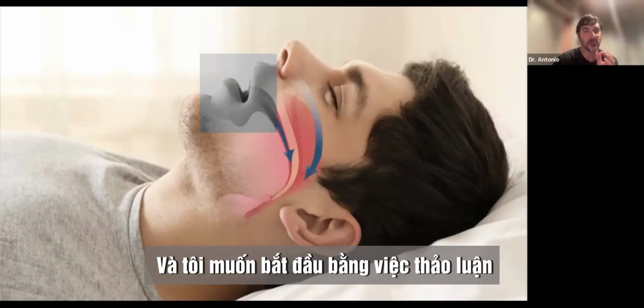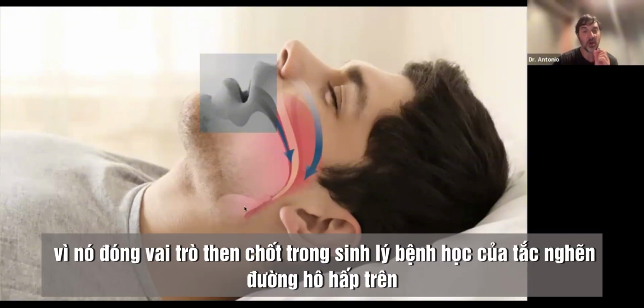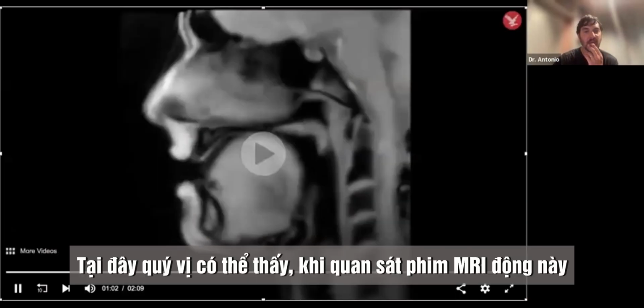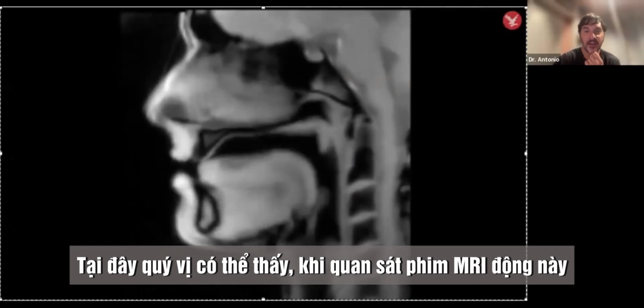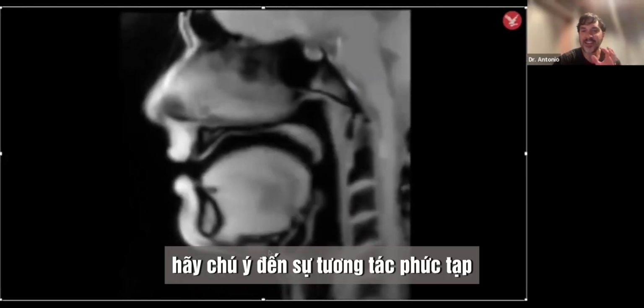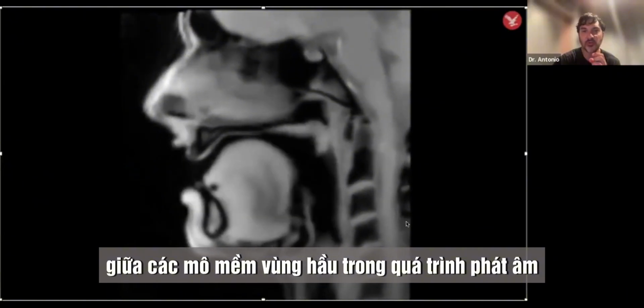I would like to start by discussing this important topic as it plays a key role in the pathophysiology of upper airway obstruction. Here you can see, as you watch this dynamic MRI, the complex interaction among the pharyngeal soft tissue during speech.